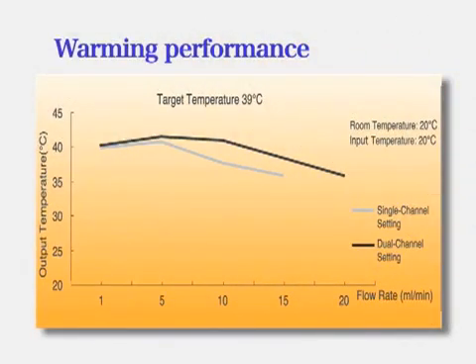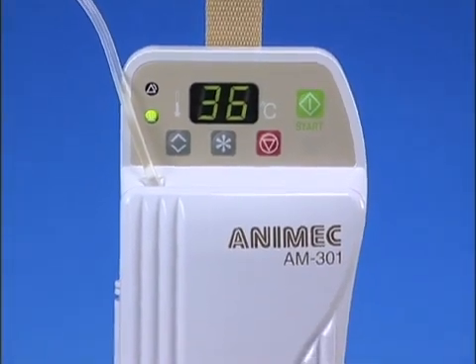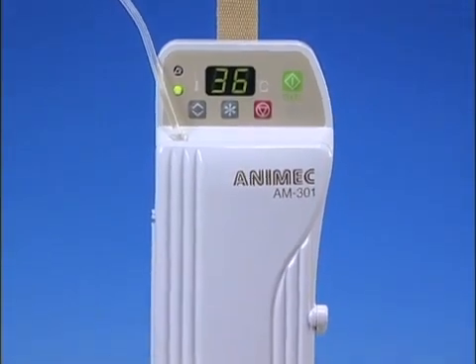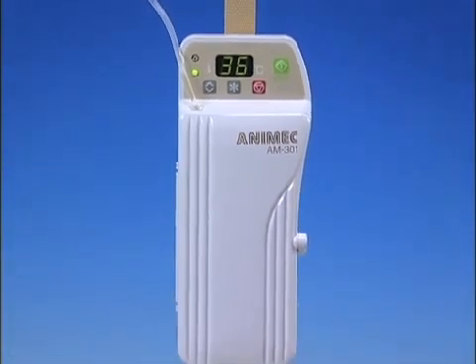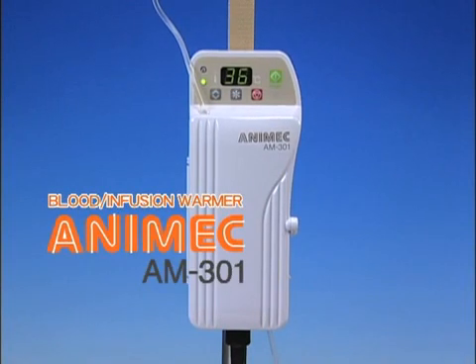This graph demonstrates warming performance. Install the Animec AM301 Infusion and Blood Warmer to ensure the safe and reliable care of your patients. Please refer to the operator's manual for more information.